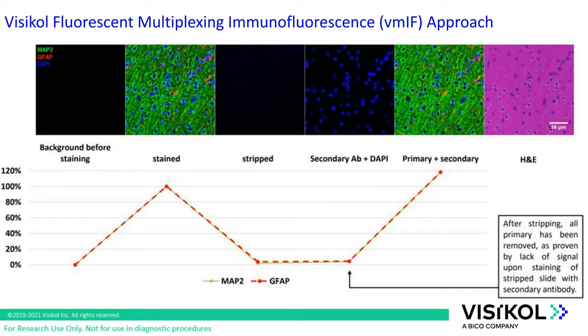Then we can repeat with new markers. In this case, we just demonstrated that the antigenicity is preserved. We can stain with the same markers and we get an almost indistinguishable image. One of the coolest advantages of this technique in the eyes of many pathologists is that after you're done collecting all of this fluorescent data, you can still go back and get an H&E slide or cross-validate with conventional immunohistochemistry techniques. And so it makes it very easy to cross-validate this new technique with the existing pipelines.